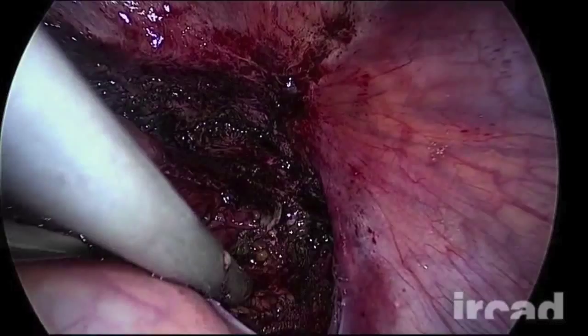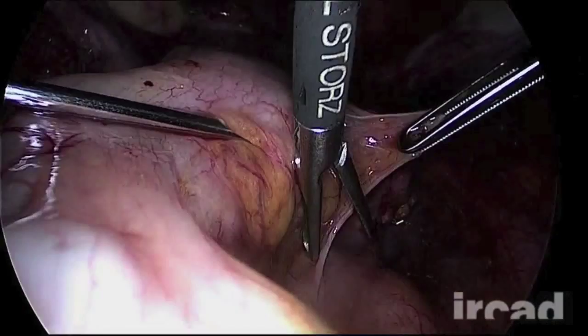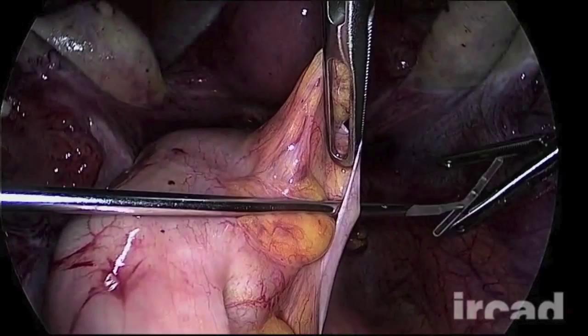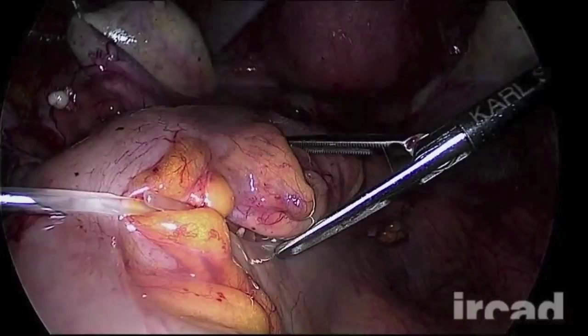The bowel is suspended laterally by the visceral peritoneum by means of two T-Lift devices. The device is orientated with its thin arm upwards to concentrate the tension, reducing the possibility of breaking either the tissue or the device. The exposure of the surgical field is improved and the assistant is free to help the surgeon.